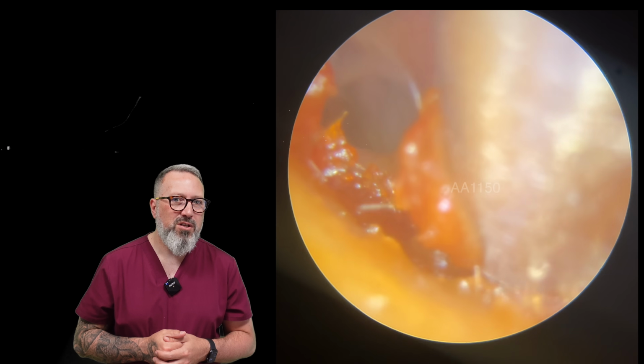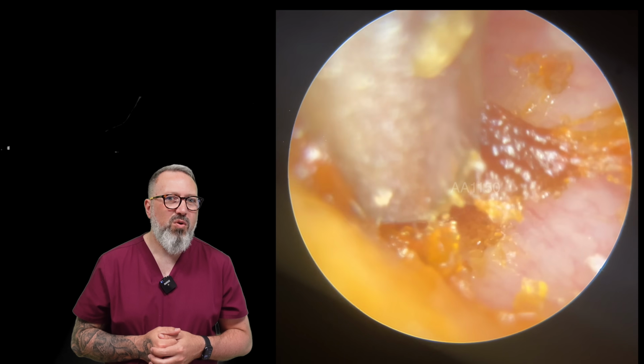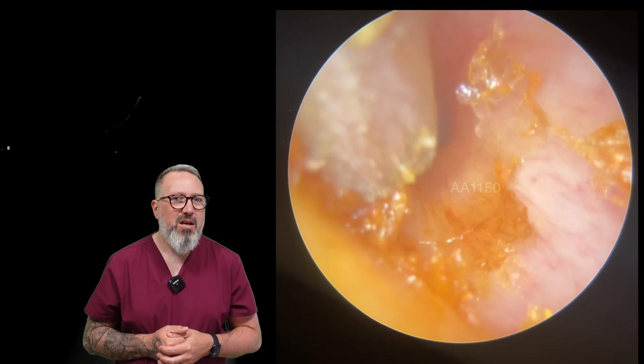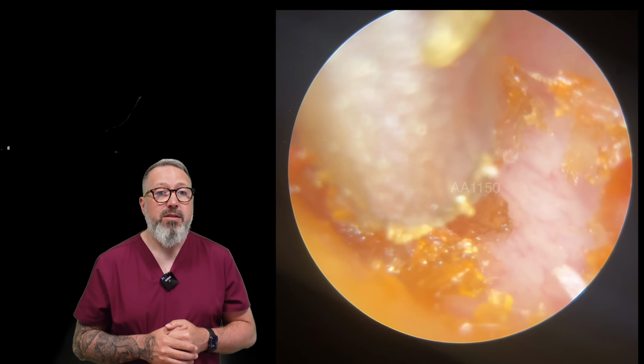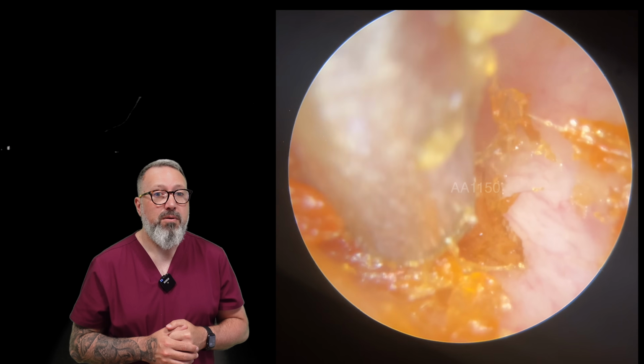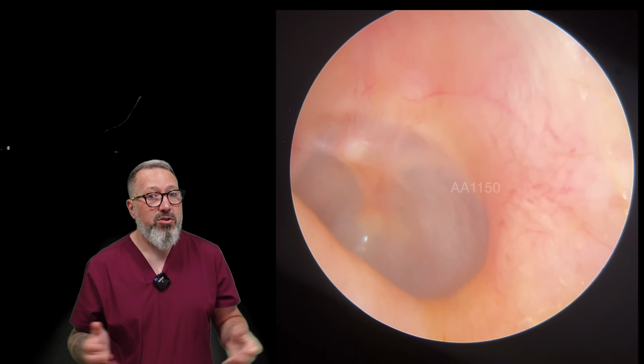So he's just going to work his way down the outside edge. There we go. It's quite tacky, this one. It naturally wants to stick to every surface, unfortunately, but it is coming away well. So we're just going to nip this top section. There we go. Let's take a look. Eardrum looking good on that side as well.